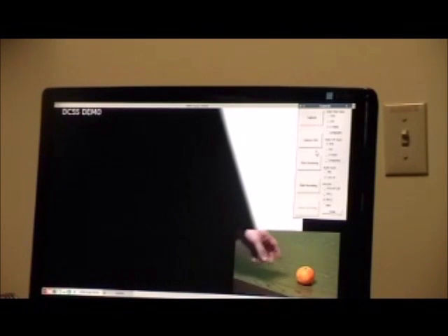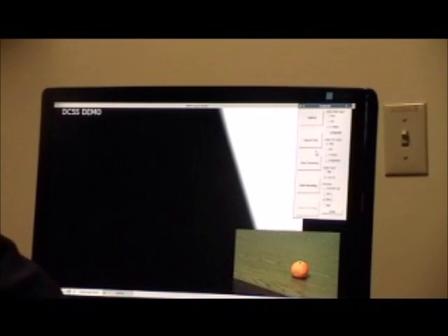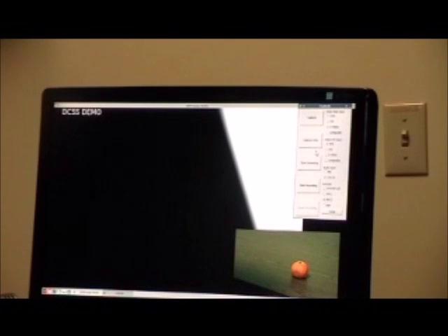In this case, we're actually using an orange, as you can see on the screen, as our patient, because the orange can give us some pretty good detail of the surface of the orange skin. So a caregiver might like to use the remote control here for the camera without having to fumble with the camera itself.